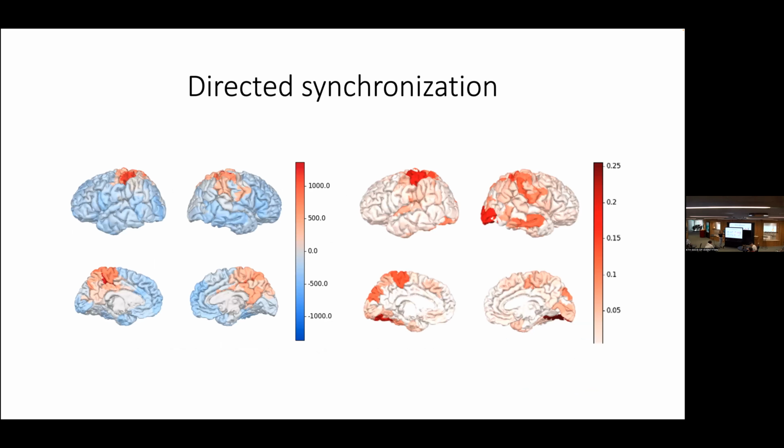Yeah, so for example, if you compare it with the undirected graphs, you have all of these areas that don't show an alpha synchronization. You have a decrease of information going there as well. But then interestingly, you have, for example, these areas here that show quite a lot of synchronization, for which there's no increase of information going from these areas.